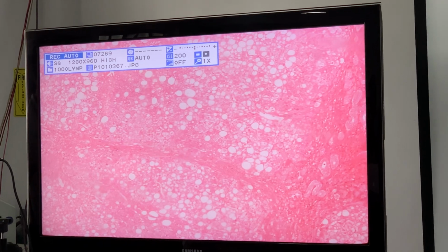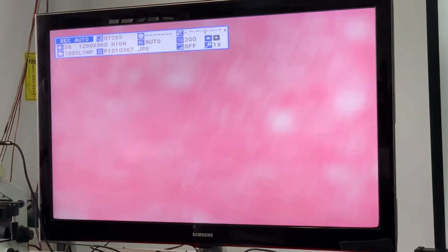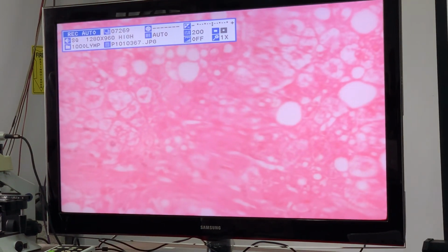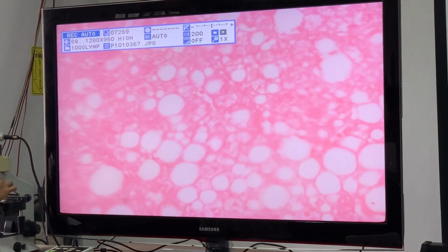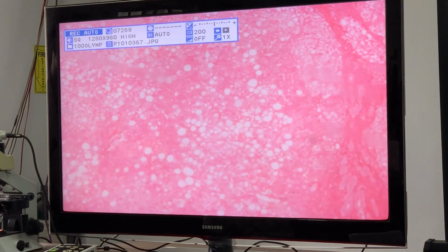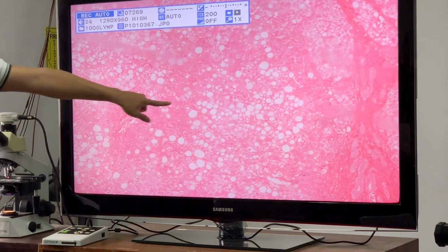This is the liver. What adaptive or cell injury do you see here? The slide is damaged. Really just too low power. So what cell injury do you see here? What do these hepatocytes have?